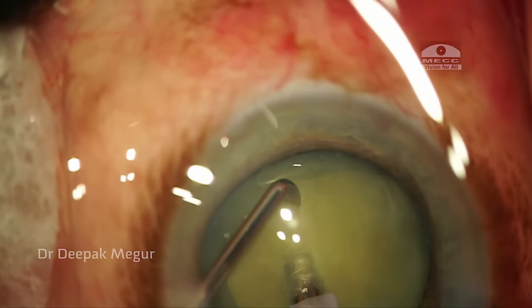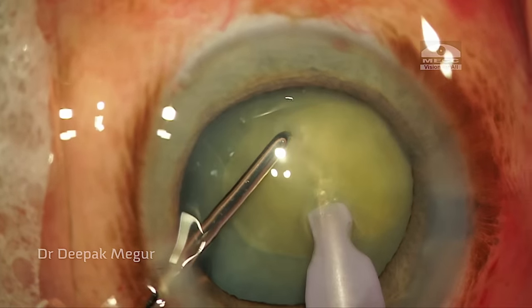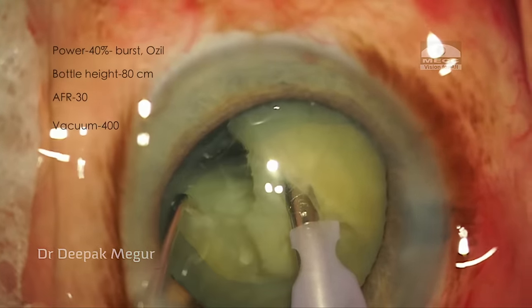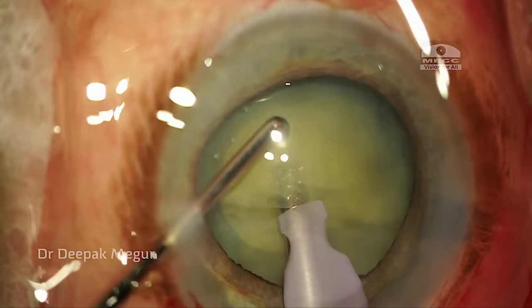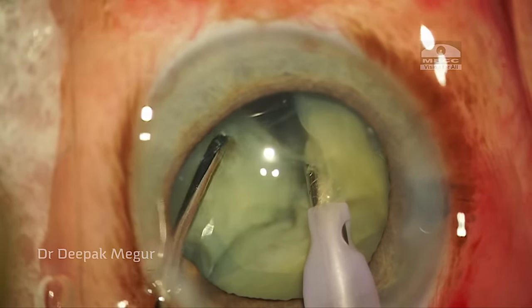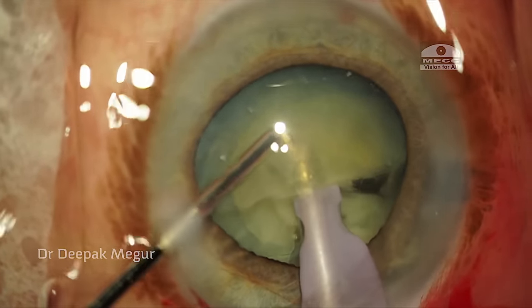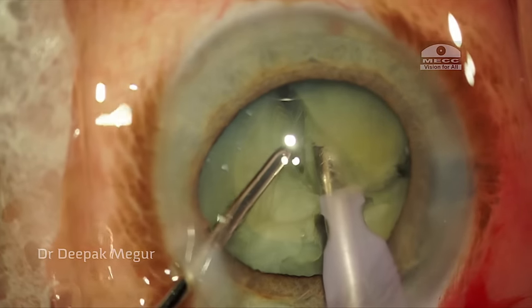I begin nucleus disassembly by performing a direct chop. I bury the phaco tip into the nucleus, pull the nucleus anteriorly, and using a sharp chopper, score directly with the direction going posteriorly, then gently separate the two fragments. I bury the phaco tip again, lift up and chop. During lateral separation, I don't move my right hand at all — predominant movement is done by my left hand alone, with separation at multiple levels to achieve the goal without inducing too much stress on the zonules.